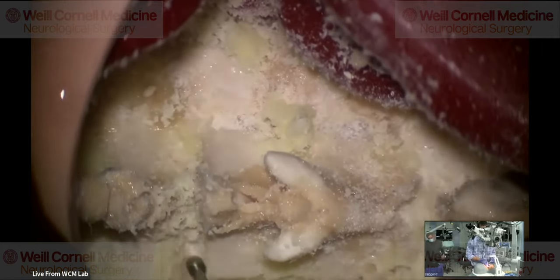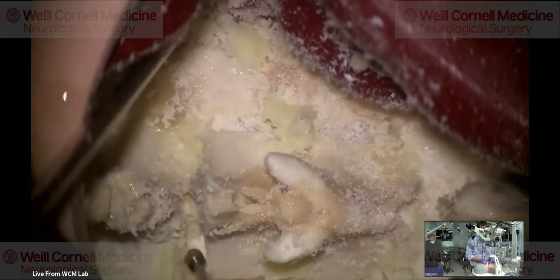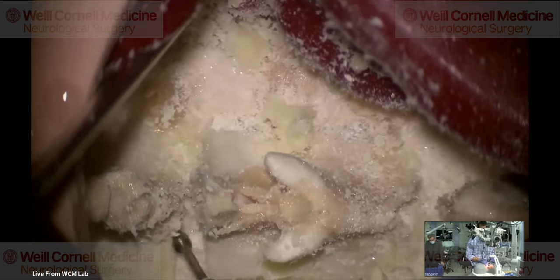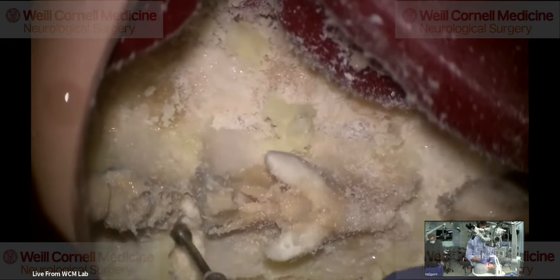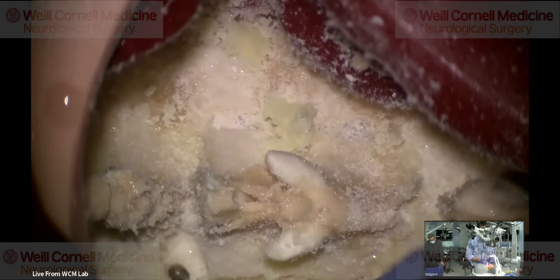That's why you've got to cut it at the top. You've got to cut it across here, and then you've got to cut it across there. And then we can do kind of a dome over here. You don't want to head into the spinous process too far, because you'll break it. But you can go into the lamina and do like a hemilaminectomy.